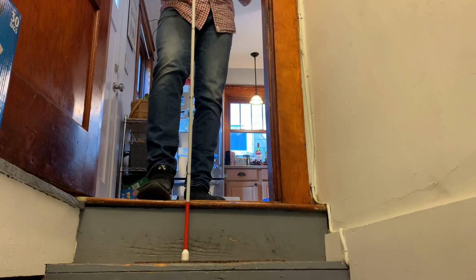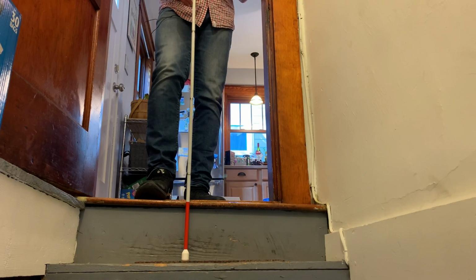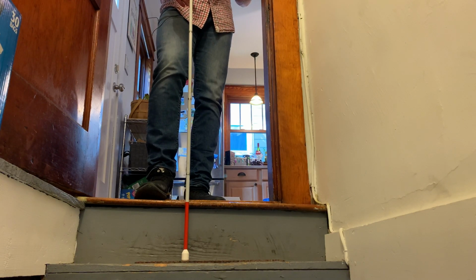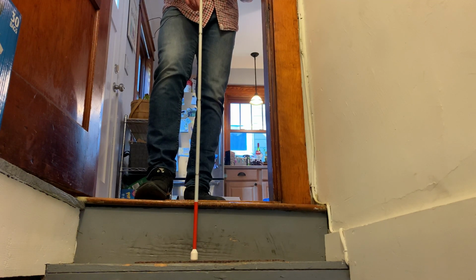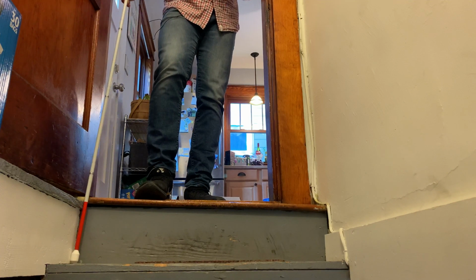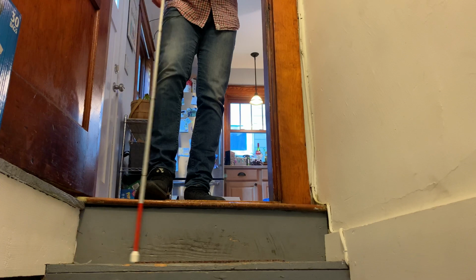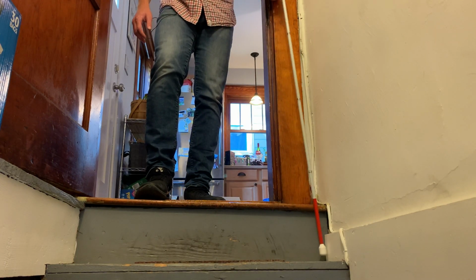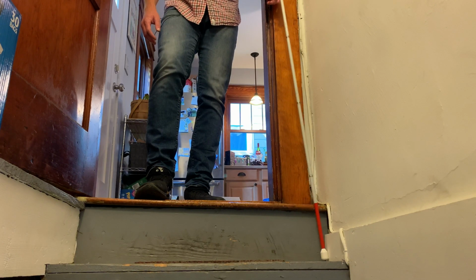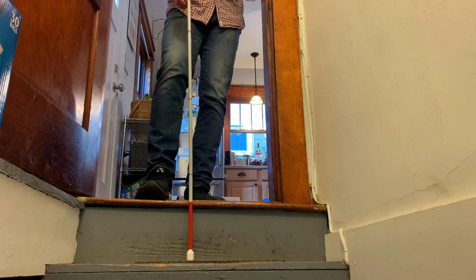Now for step three. I have my cane vertical, straight up and down, and my foot has found the edge of the stairs, so I want to check where my placement is on the stairs. To do that, I'm going to grab the cane with my right hand and sweep it to the right, still vertical, just to get an idea of my placement on the stairs. Then I'll bring it back to center, grab it with my left hand, and check to the left until I can't go any farther, just to see where I am on the stairs. I'm pretty centered on the stairs right now, so that's really what I'm looking for.